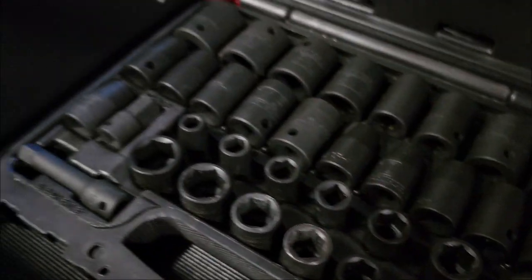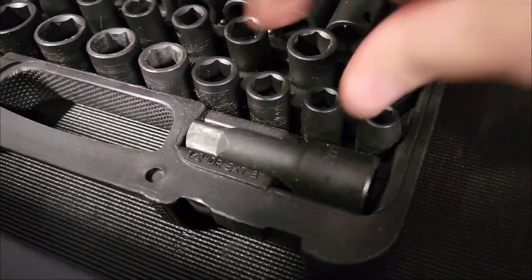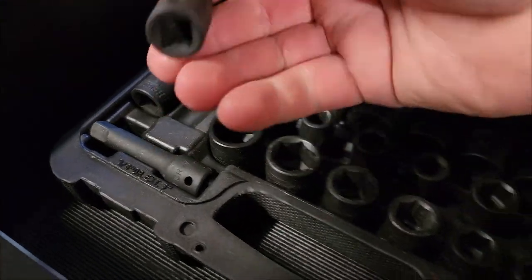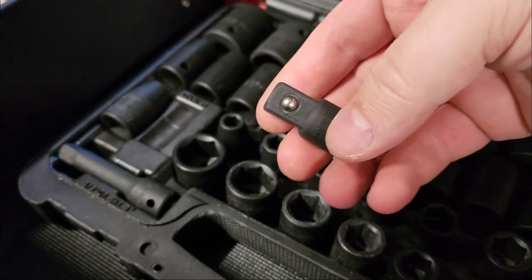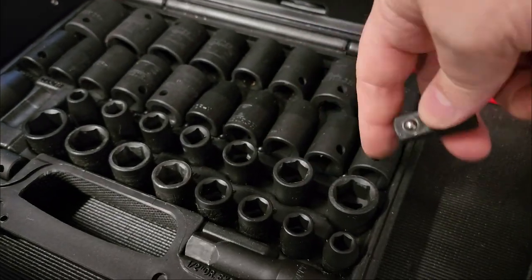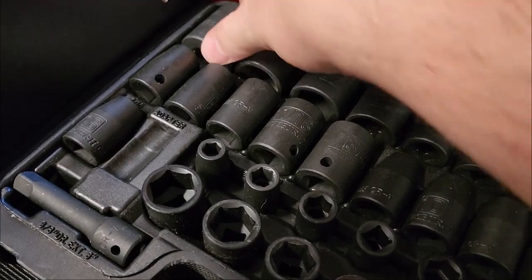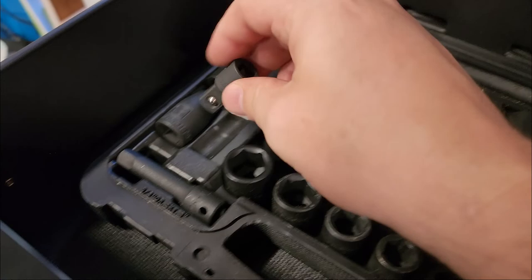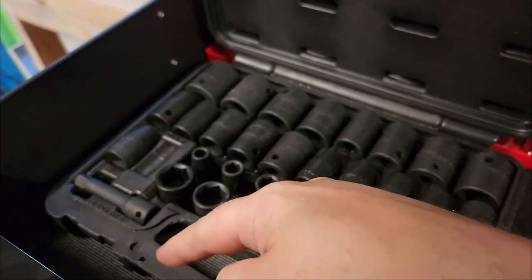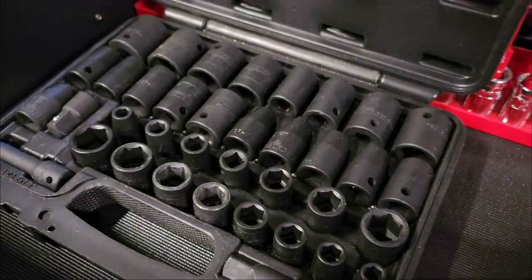There are also impact-rated extensions and adapters. Here's a three-eighths to half-inch adapter — so you can plug a three-eighths drive extension into a half-inch socket set. But remember, as I said earlier, the more extensions between the source and the fastener, the more torque you lose. That's just physics.